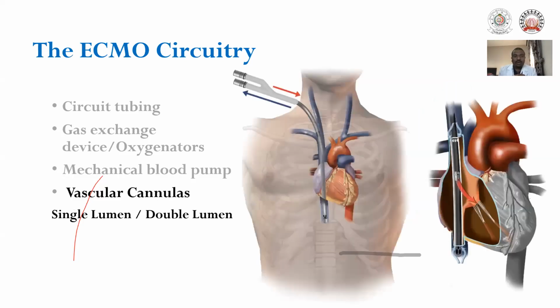Next one is about the cannula. There are usually three ways of accessing the major vessels for ECMO: mainly central cannulation, which is surgical, surgical peripheral cannulation, and percutaneous cannulation. The internal jugular veins, femoral veins, and the right atrium are mostly opted for venous circulation, whereas for arterial cannulation, carotid arteries, femoral arteries, and the aorta respectively can be used.